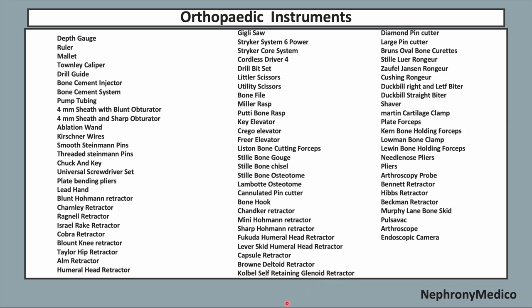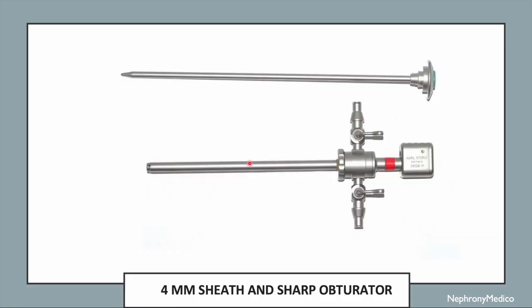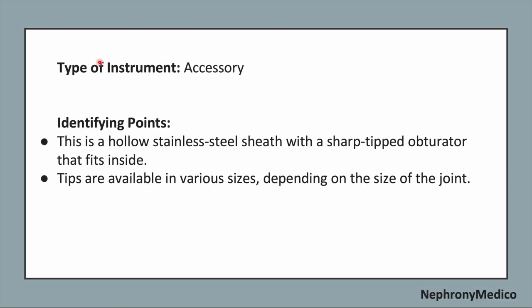Hello and welcome. Let's talk about orthopedic instruments. So, let's talk about 4mm sheath and sharp obturator. This is a picture showing 4mm sheath and a sharp obturator. It is an accessory type of instrument.